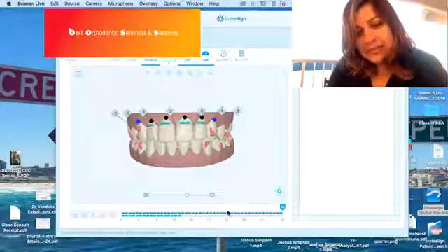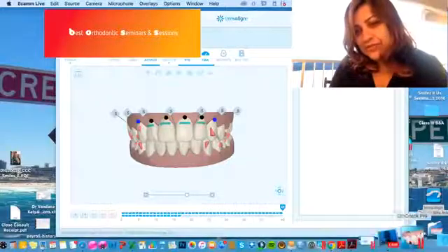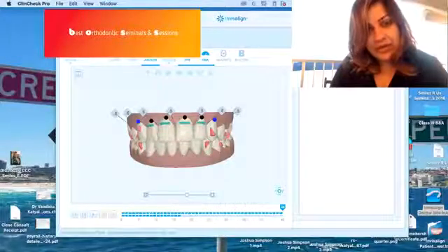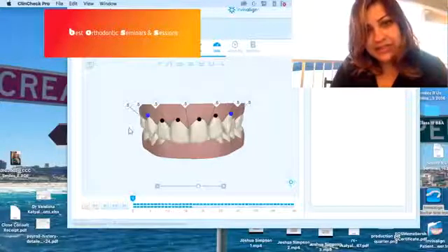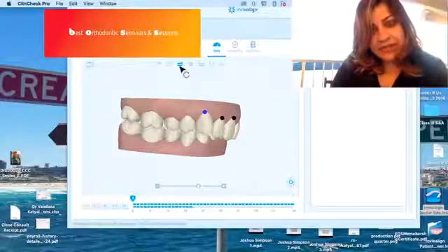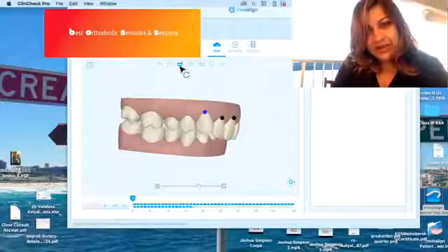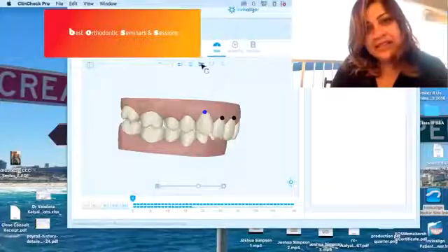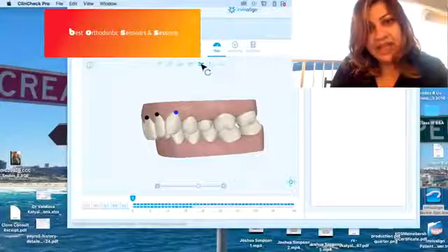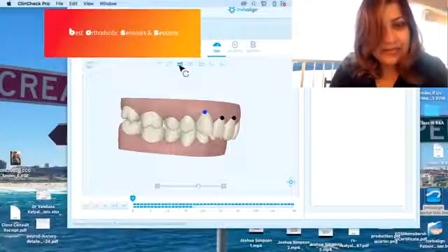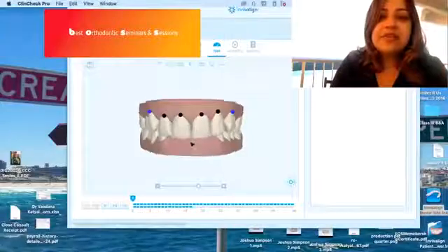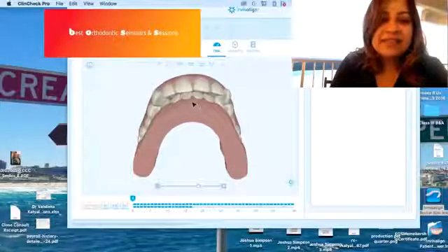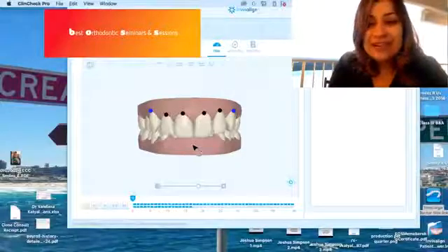I've got this dentist who's asked me to coach this case and I'm going to go back to the pre-treatment. This is the pre-treatment condition of the patient. Let's ignore all attachments, all IPR for now. This is the buccal shot. You can see this is a 17-year-old young adult patient. It's a Class 2 Division 2 malocclusion with deep bite. Let's see the left side buccal shot. The Class 2 is more full unit on this side than the right side.